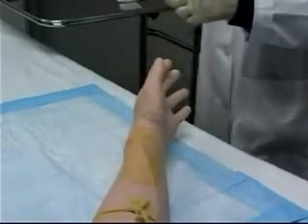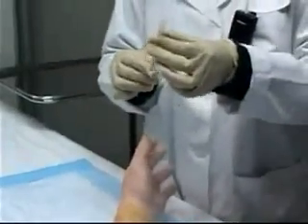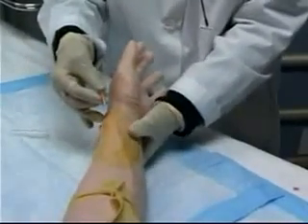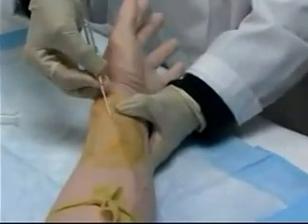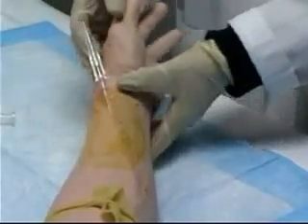Now that the area's been prepared, I'm ready to actually insert the IV. Slide the cap off, making sure my needle's bevel is up. Applying a little bit of counter traction to the skin near the vein I've chosen, bevel up needle, I'm going to go in right on top of the chosen vein, pushing the needle through the skin and into the vein.